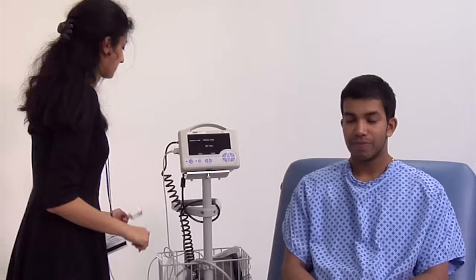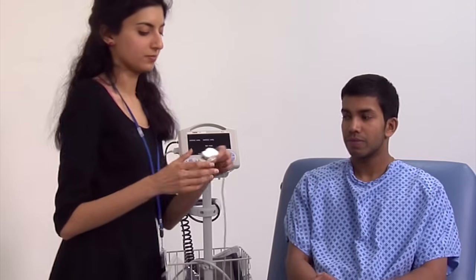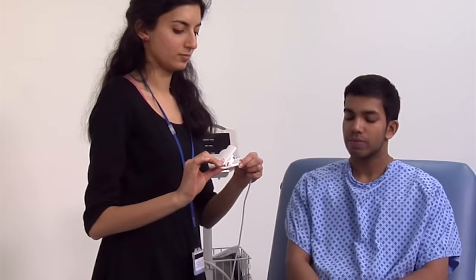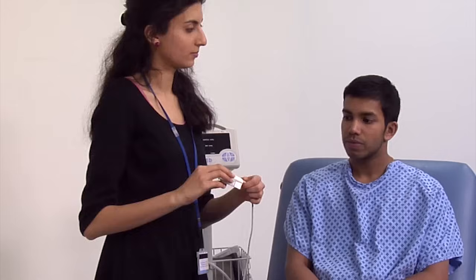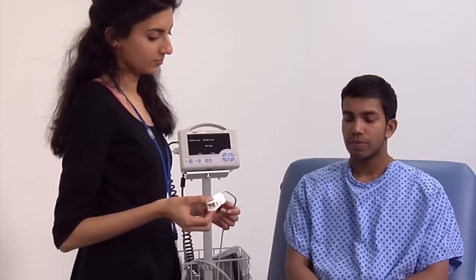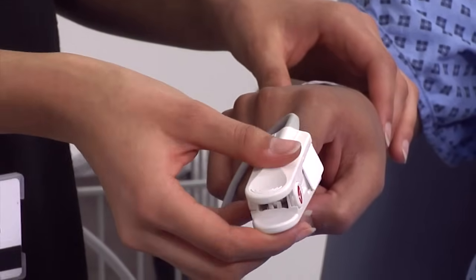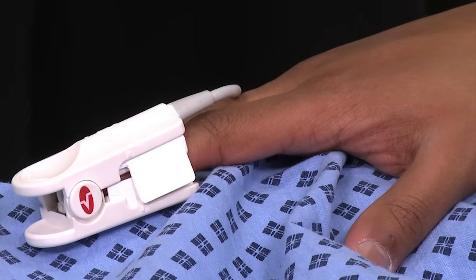If a patient is showing signs of respiratory distress, we can check how well they are oxygenating blood using a device called a pulse oximeter. This is a non-invasive way of measuring the SpO2, which is the oxygen saturation of arterial blood. The device is placed on the nail bed of the finger, and the probe should be fitted securely. Any nail polish must be removed, as it can interfere with the reading.